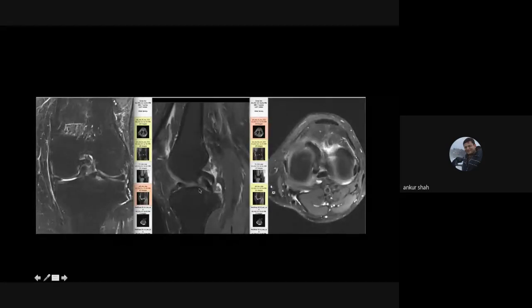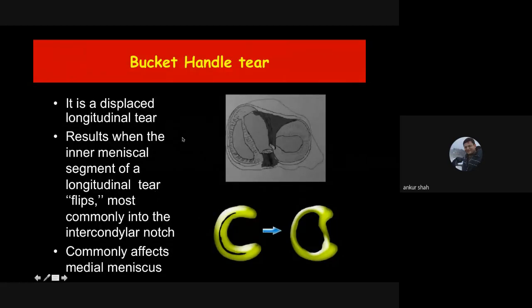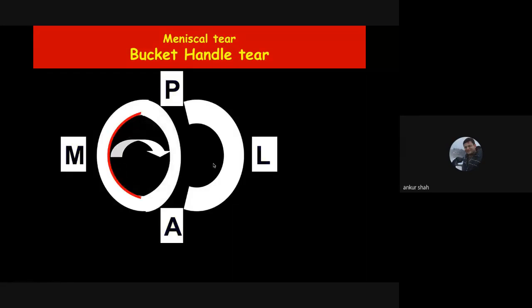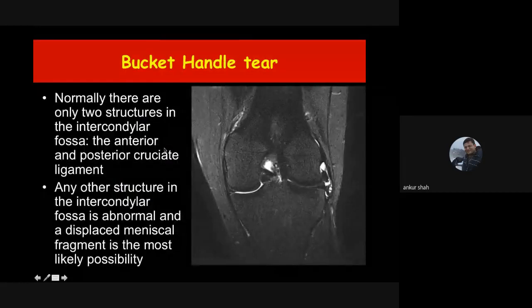When after a longitudinal tear the meniscal fragment flips and goes into the intercondylar region, this results in the bucket handle tear. This is the most common appearance of the bucket handle tear — the displaced longitudinal tear, like a handle of a bucket opening up.